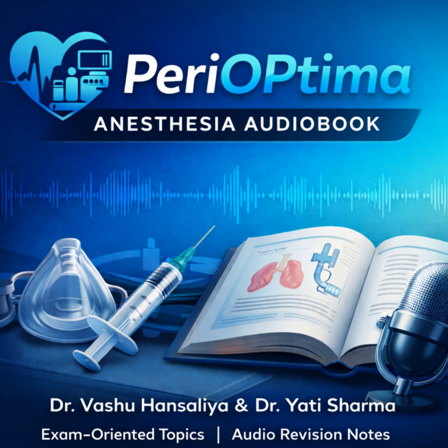Correct. And that is exactly why it fails in certain situations. When does the cuff lie to you? In shock states, definitely, when pulses are weak. Also in severe arrhythmias like atrial fibrillation, the irregular beat just confuses the algorithm, and extreme obesity. Cuff hypertension. If the cuff is too small for the arm, you get falsely high readings. You've always got to match the cuff size to the arm circumference.